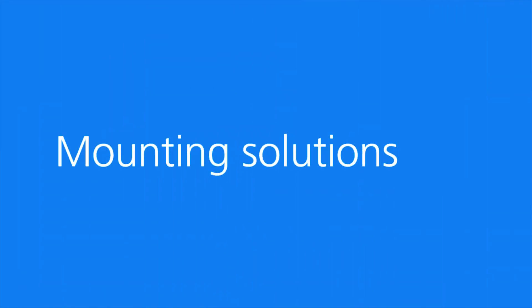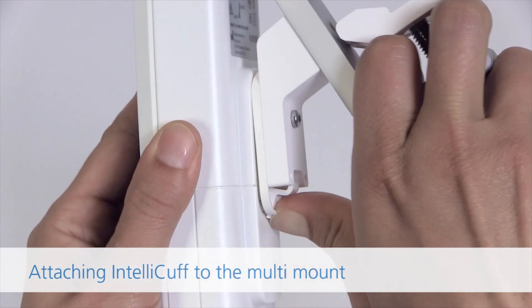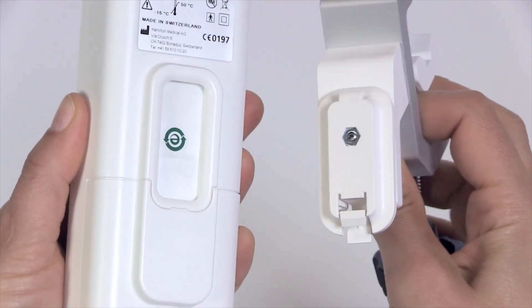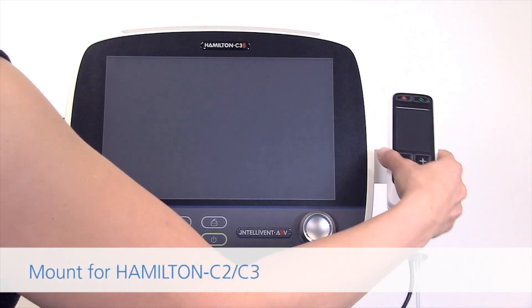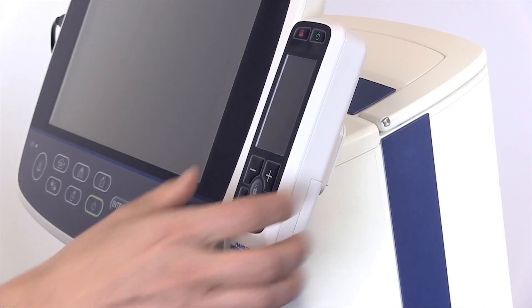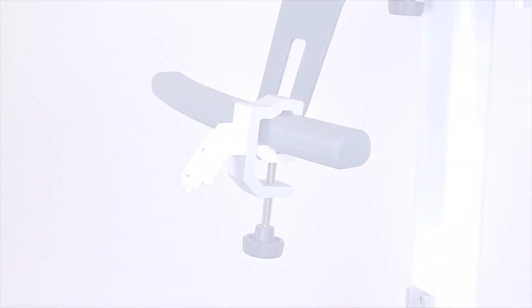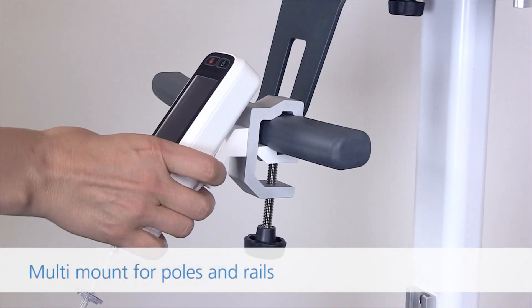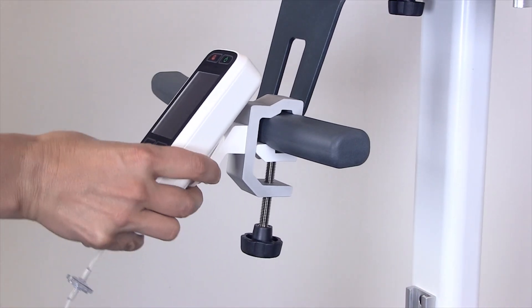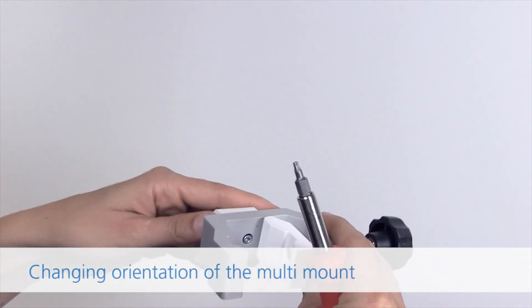Mounting solutions. Attaching the IntelliCuff to the multi-mount. Mount for Hamilton C2-C3. Multi-mount for poles and rails. Changing the orientation of the multi-mount.